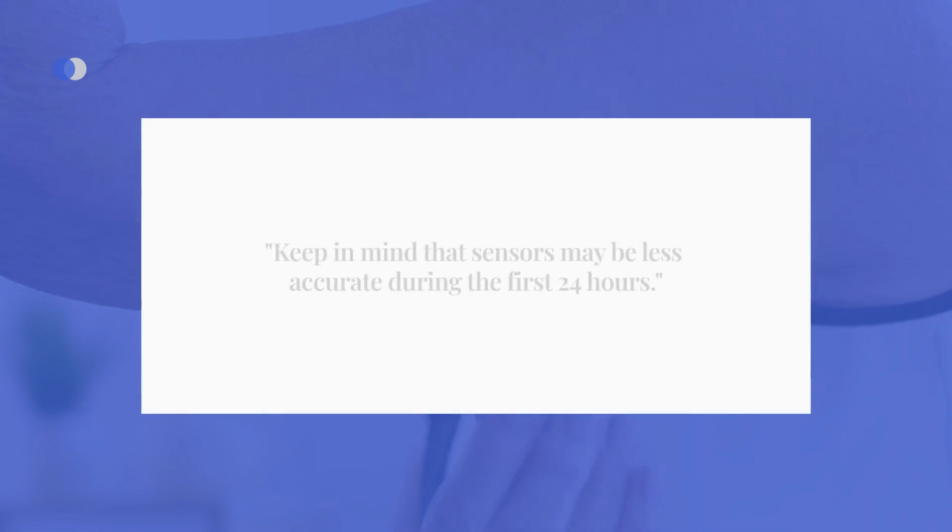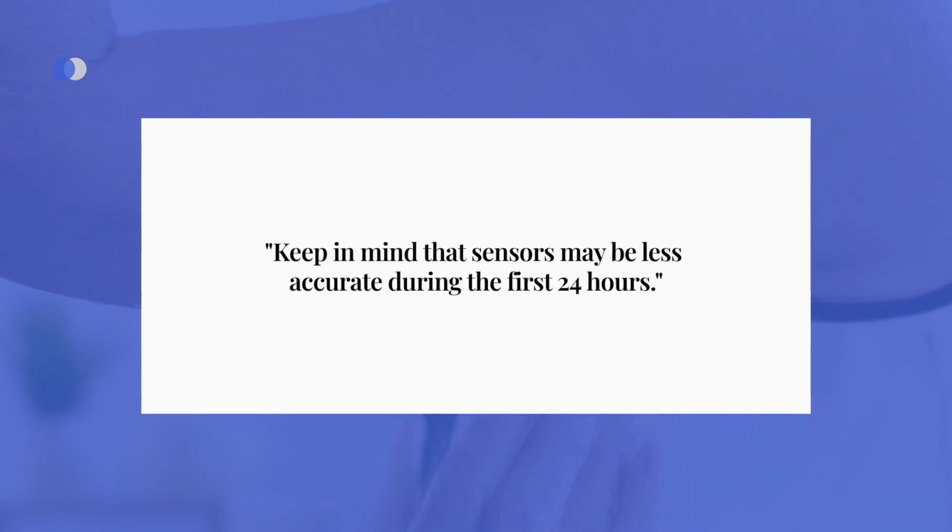It's important to keep in mind that sensors may be less accurate during the first 24 hours. So be cautious when taking insulin or consuming sugars based on your sensor readings during this time.